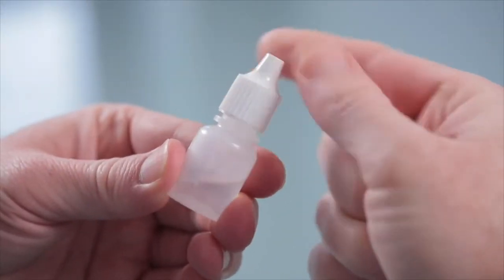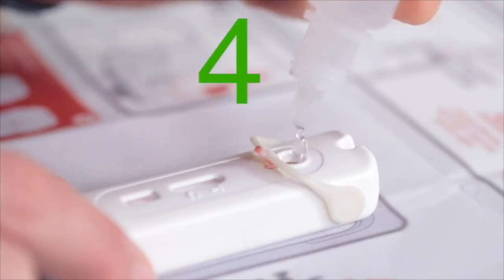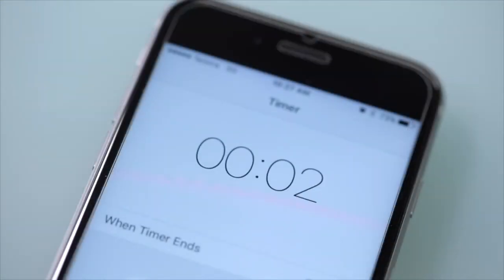Now add four drops of test fluid into the well on top of the blood. Set your timer and wait 15 minutes before reading the result. Reading the result before 15 minutes could give you a false result. However, do not wait longer than 20 minutes.